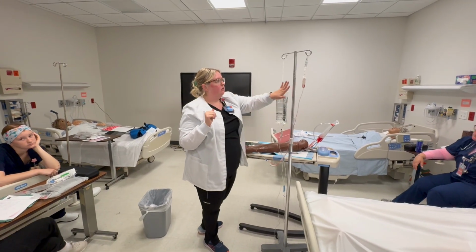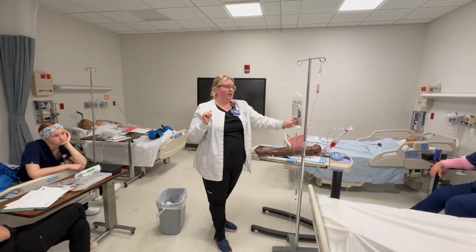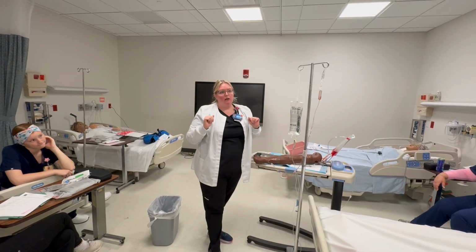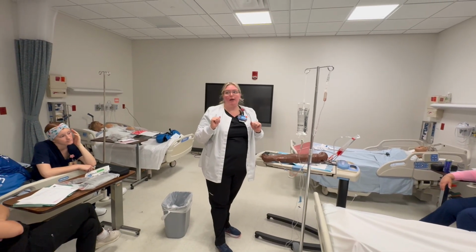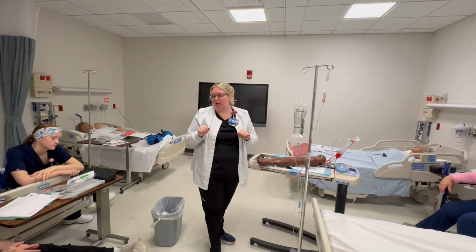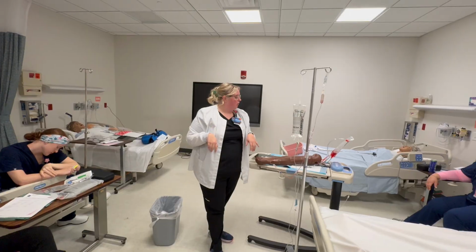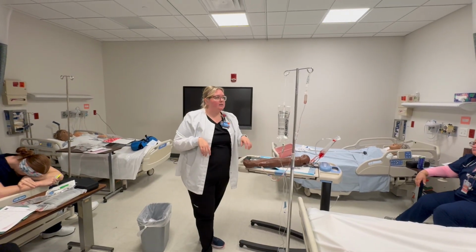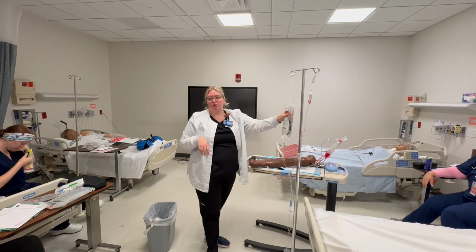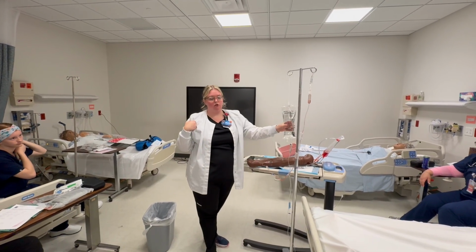Another thing that we want to do, and it's in your checkoff and I didn't address it, is checking compatibility. These are essentially different chemicals, right? Some chemicals don't mix well, so when you look up a medication, you have to check compatibility. Gentamicin is mixed in normal saline, so I know that this normal saline and the mixed gentamicin are compatible because it's literally mixed in the solution.